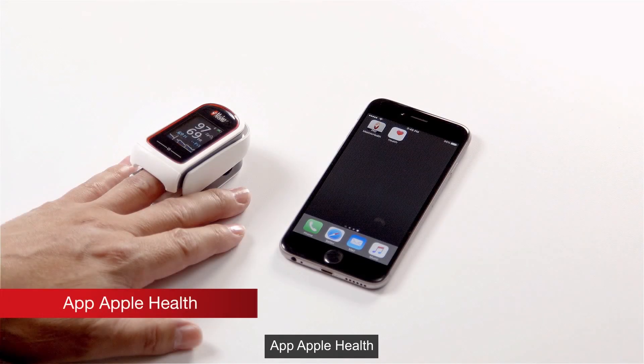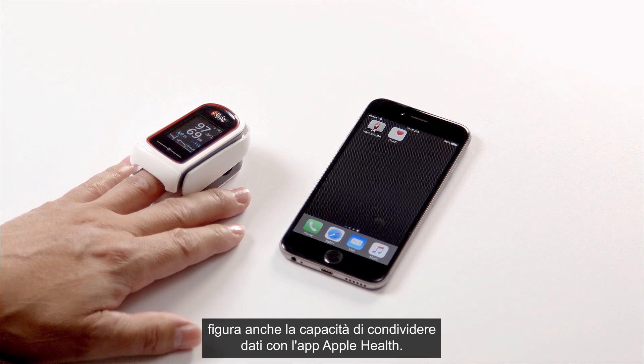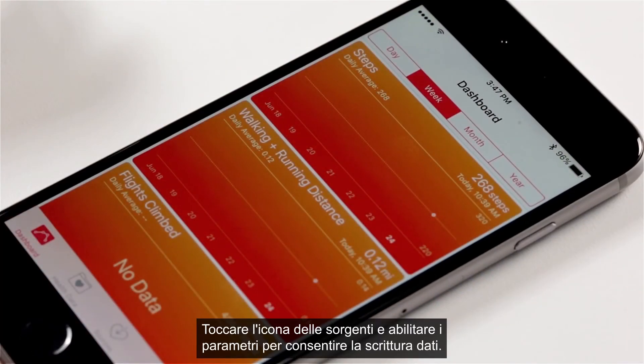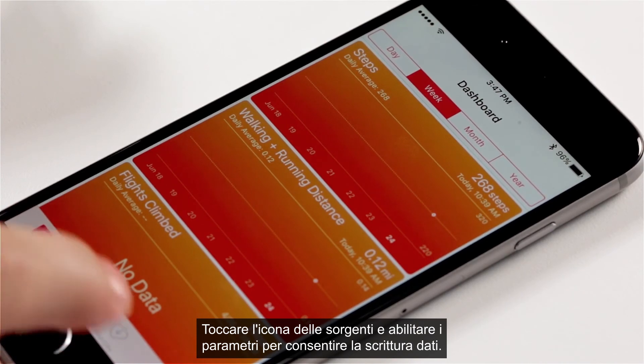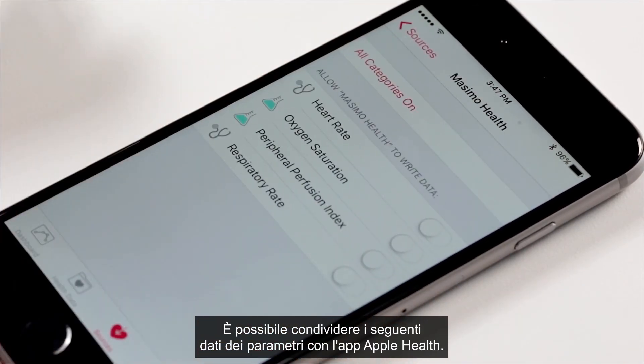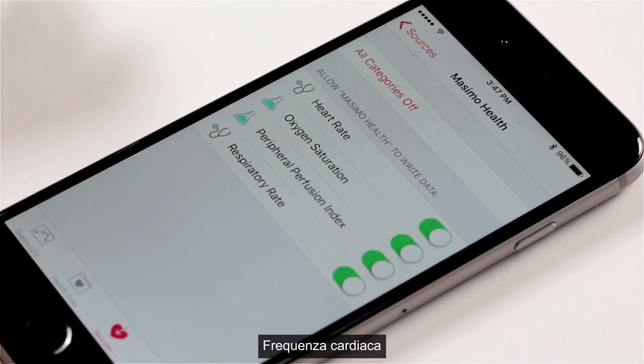Apple Health App. Additional features of the Masimo Professional Health app include the ability to share data with the Apple Health App. To share the data, open the Apple Health App, tap on the sources icon, and enable the parameters to allow Masimo Health to write data. You may choose to share Heart Rate, Pulse Rate, Oxygen Saturation, Perfusion Index, and Respiration Rate.